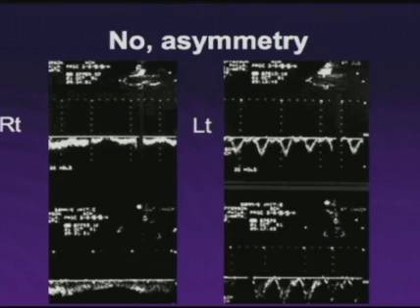So I hope we reviewed successfully for you the techniques and interpretation of upper extremity venous disease.